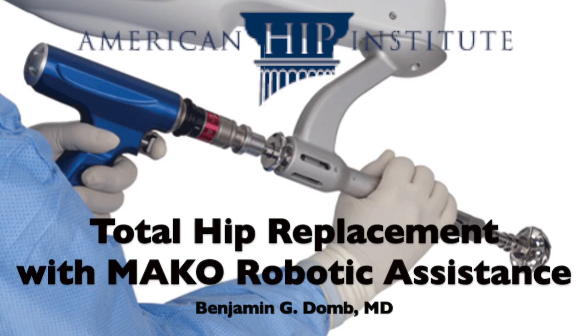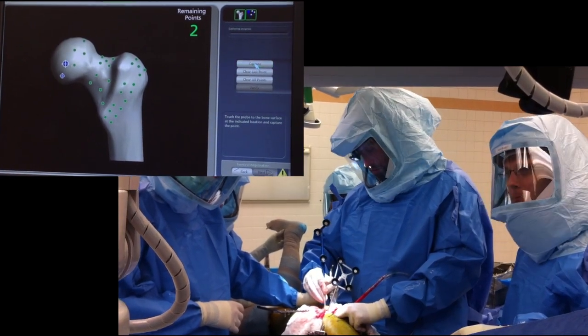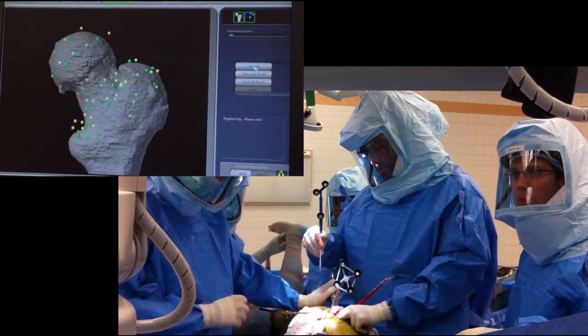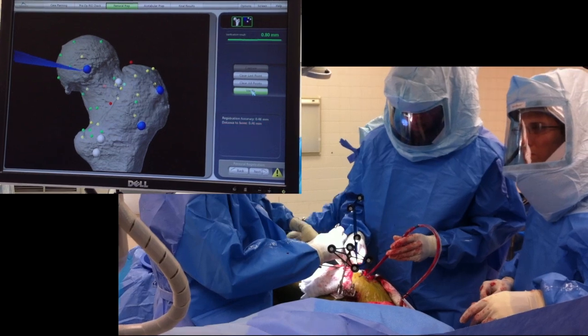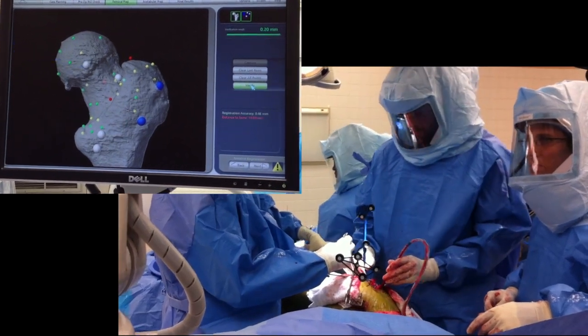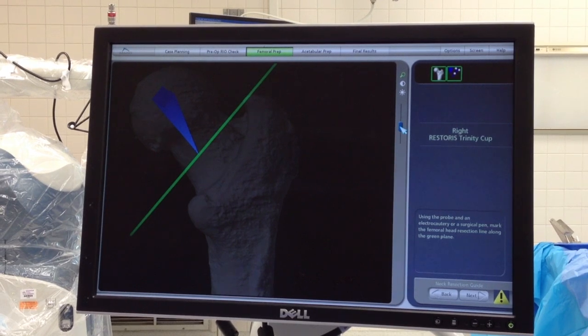This is a video demonstration of a robotic hip replacement performed with the MAKO technology. We begin the procedure by registering the femur, which is done based off of the three-dimensional CT-based model. This virtual model allows us to understand the three-dimensional geometry of the hip and achieve accurate placement of the components.